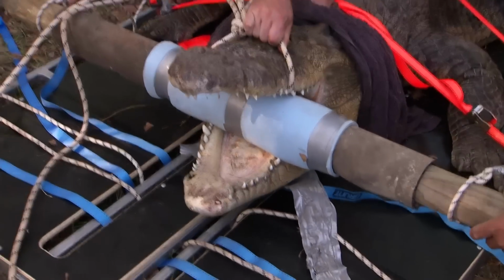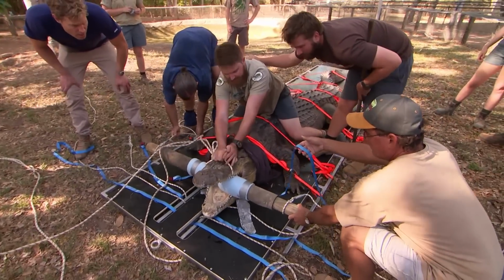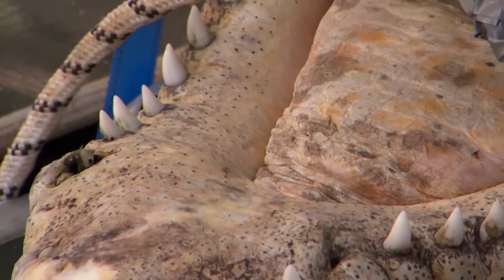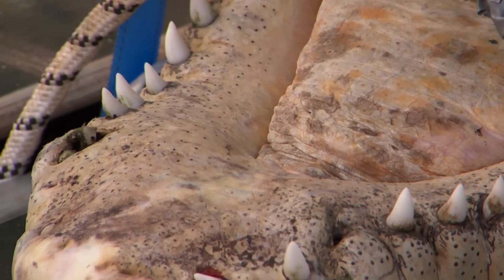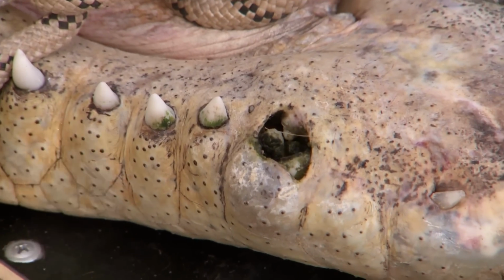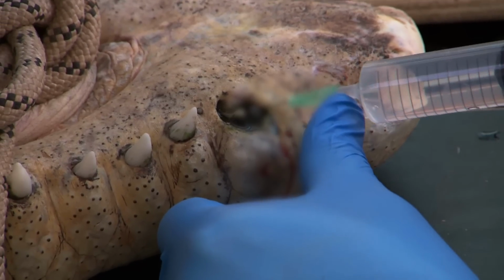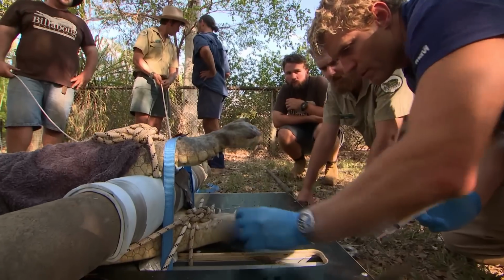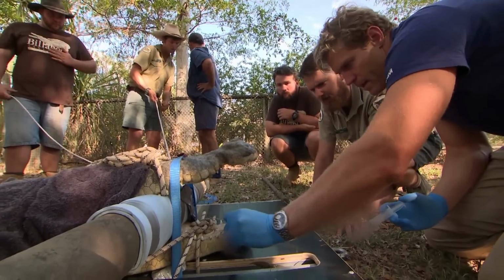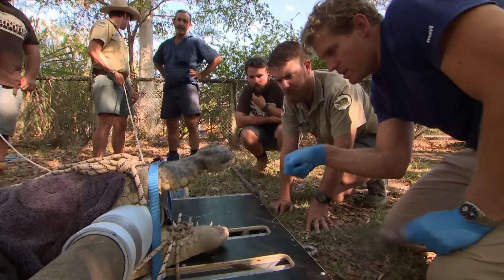Okay, we're in. This is Chris's first chance to get a good look at Riley's jaw. Yeah, wow. Straight away I get a picture of the issue that Riley's facing, and it is extraordinary. That hole in his jaw is definitely not normal. All right, so I'm happy with that in there. We've basically filled up that pit there. Yep. And all around the surrounding structures. So now I'm going to get in there and actually start exploring.